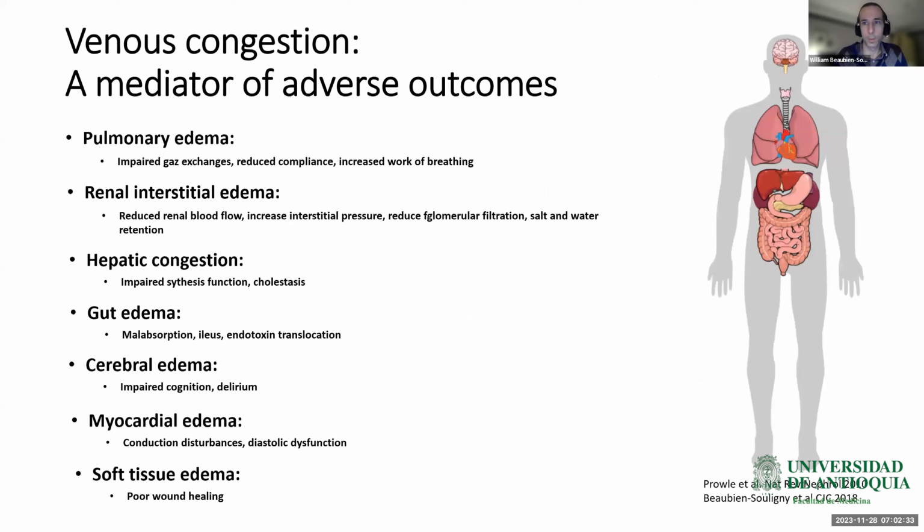While it wasn't our primary objective in this first study, we found that the presence of portal vein pulsatility was also associated with increased risk of major complications after surgery, even after adjustment for RV dysfunction and pre-op risk factors, and was also associated with longer duration of post-op support after surgery.